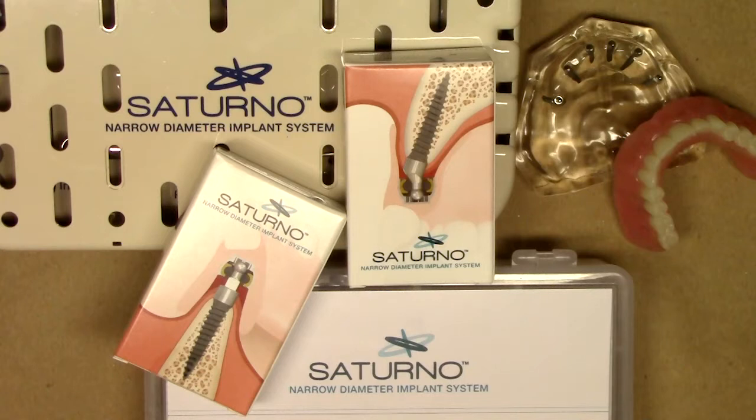Hello, this is Dr. Michael Shear with Learn Saturno, a free resource on how to market, treatment plan, place, and maintain Saturno overdenture implants. The purpose of this YouTube video is to describe the new and exciting Saturno narrow diameter implant system. Laid out in front of you is the entire system and the components that we'll be discussing today. This is the introductory video to the Saturno implant system.